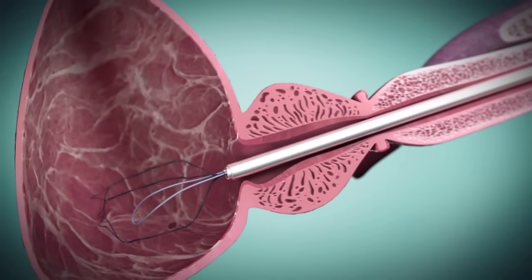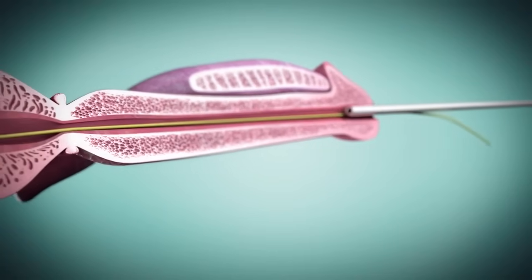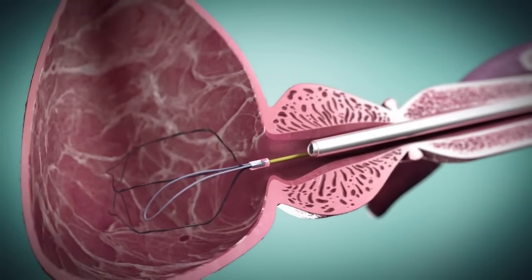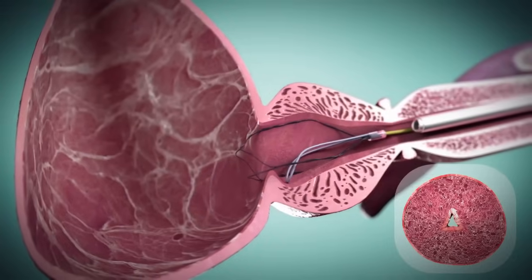The cystoscope sheath is withdrawn. The optics are reinserted and the cystoscope sheath and optics are guided back in parallel to the ITIND delivery system for visualisation. The ITIND device is manipulated to bring the anchoring leaflet into the 6 o'clock position and distal to the bladder neck.